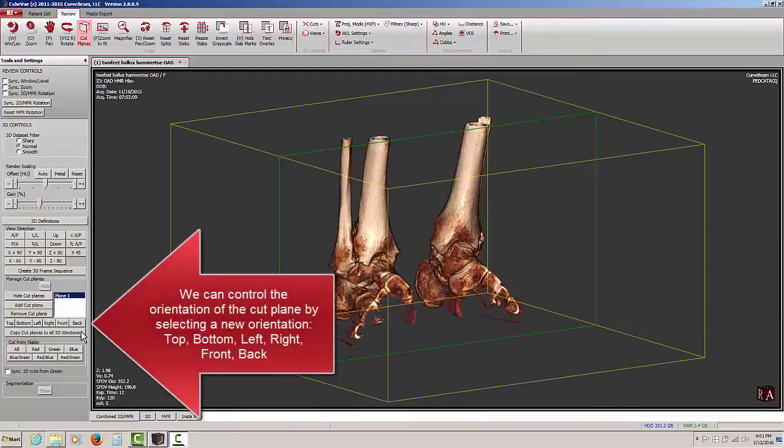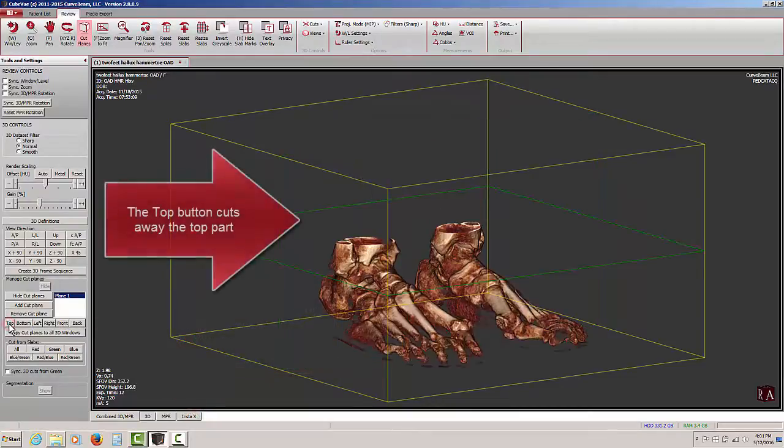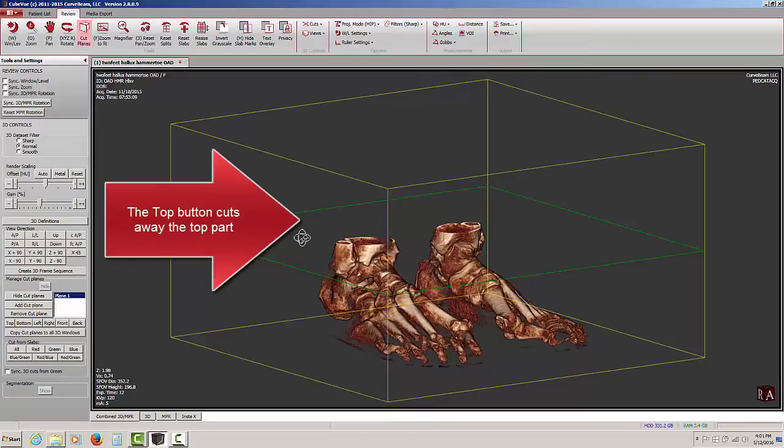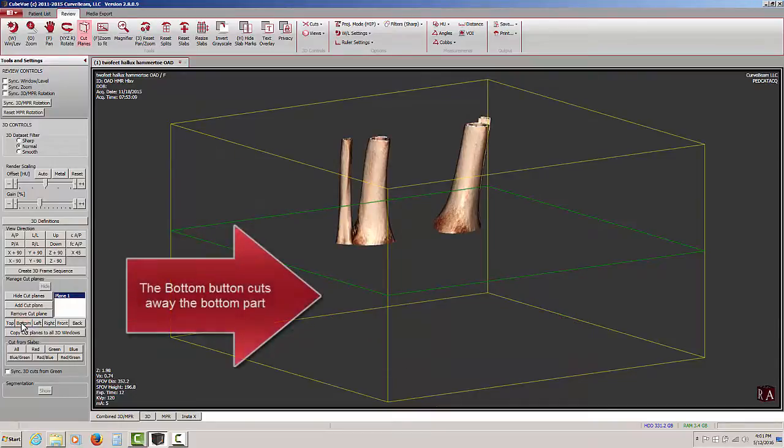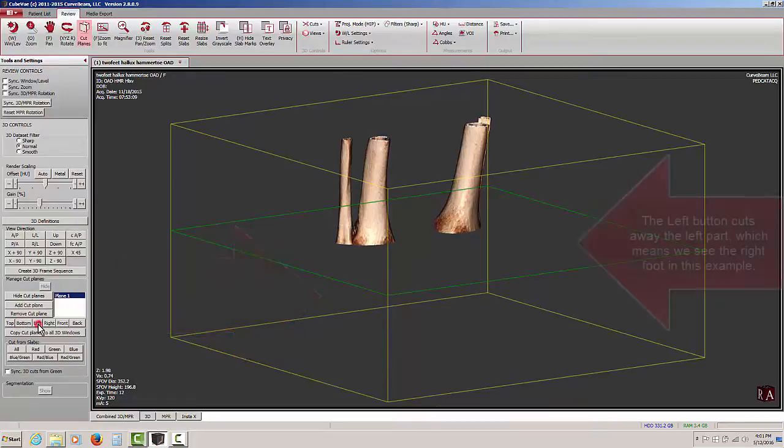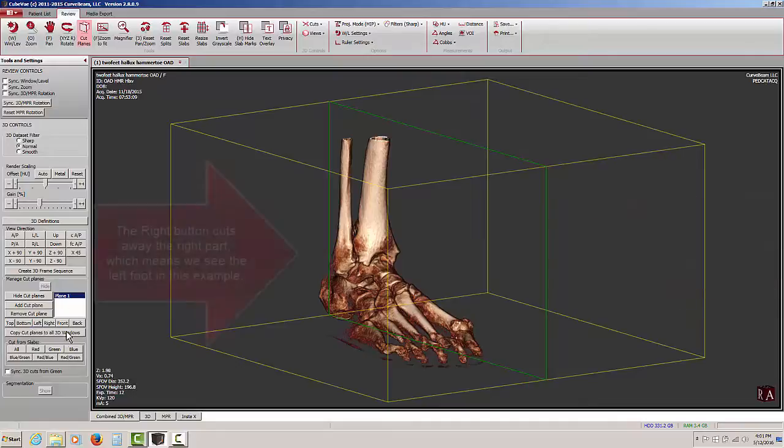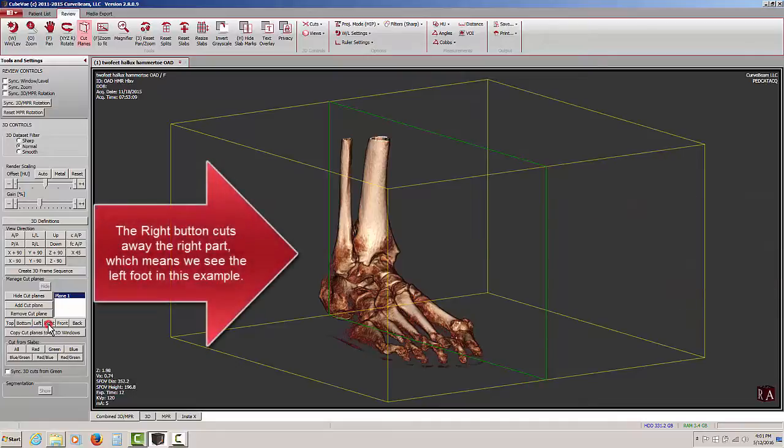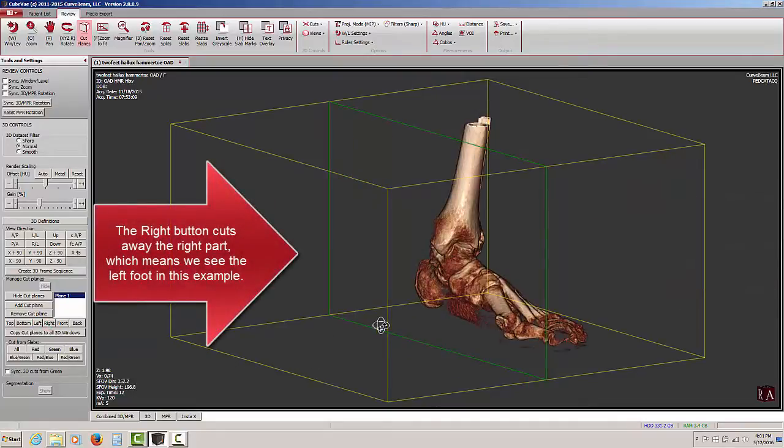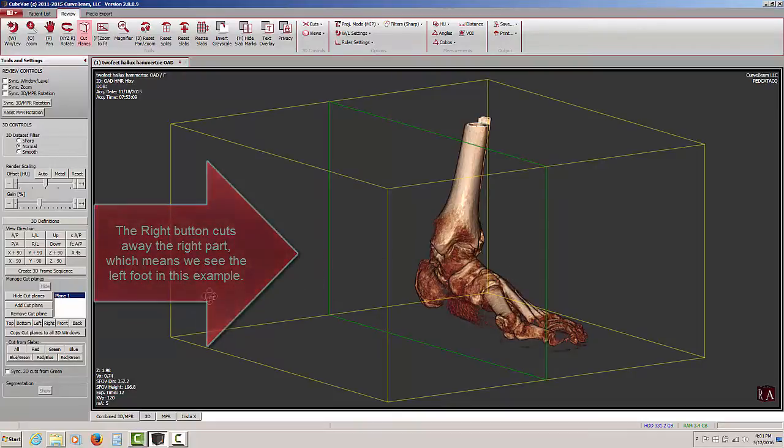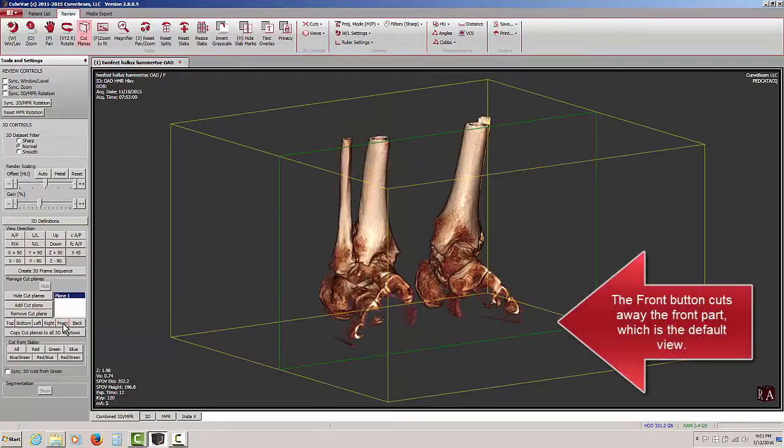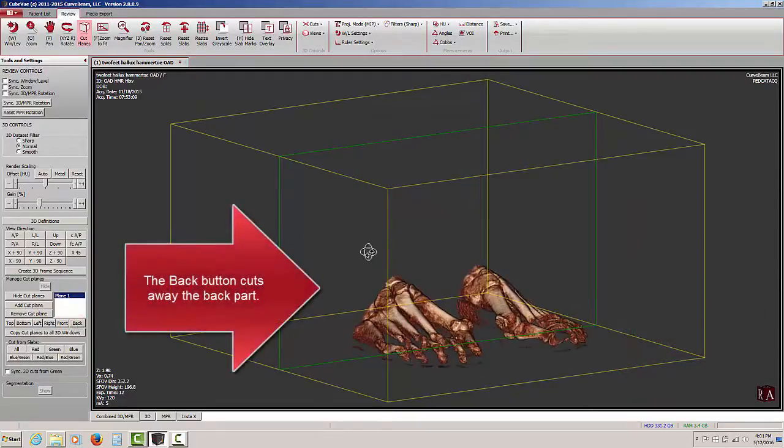We can control the orientation of the cut plane by using these buttons that say top, bottom, left, right, front, and back. When we click on the top button, we see that the top part of the data set has been cut away. When we click on the bottom button, we now see the bottom part is missing. When we click on the left button, we see the left side is missing, so we're now looking at the patient's right foot. When we click on the right button, the opposite occurs. We can now see the patient's left foot because the right side has been removed from view. Clicking on the front, this is our default view. And clicking on the back is the opposite, we're cutting away the back part of the data set.